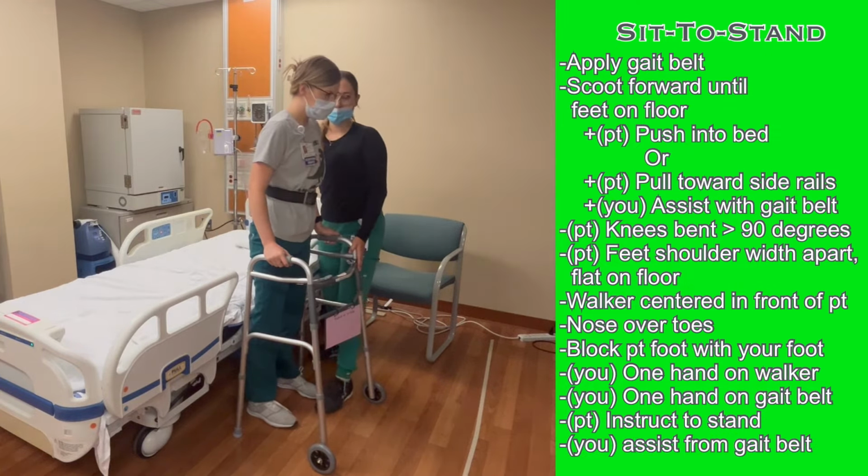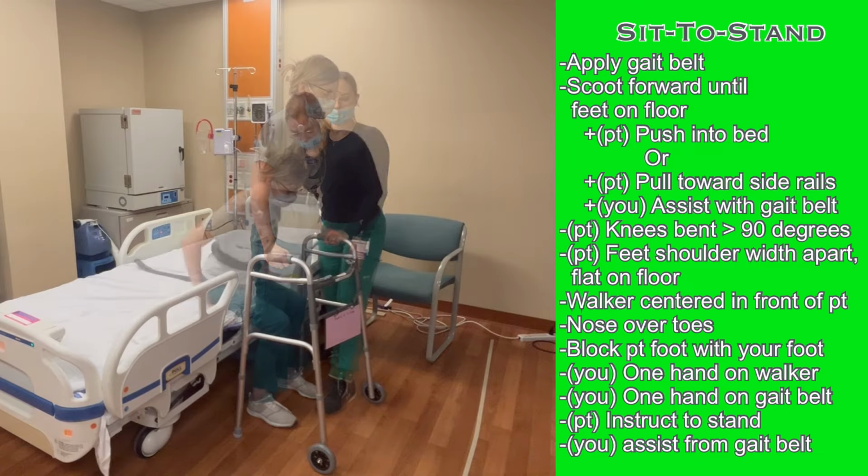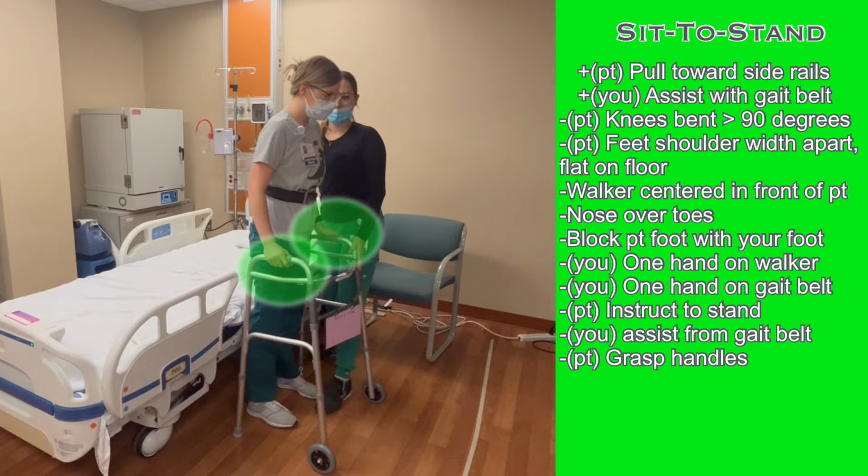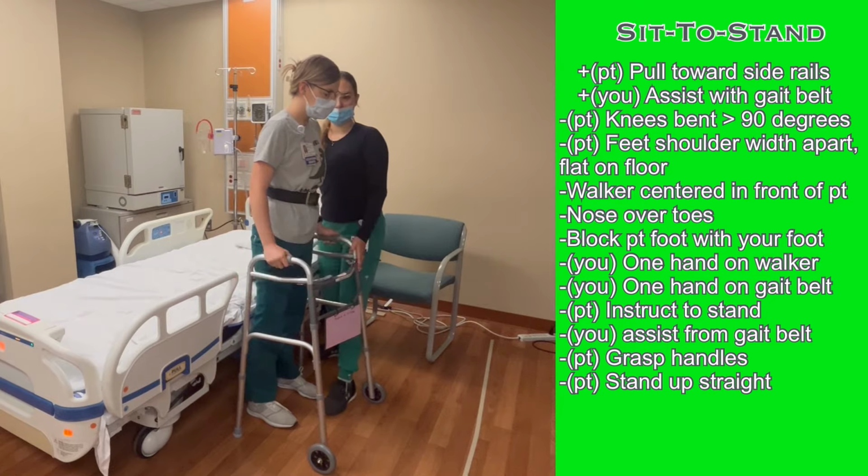Aid the patient from the gait belt, again, standing with a wide base of support and supporting the patient with strength from your lower body, not primarily your arms and back. Once the patient is standing, they should grab the handles of the walker and gain their balance. If the walker is appropriately sized, they should have a slight bend in their elbows when standing up fully. The patient is now ready to ambulate with the walker.